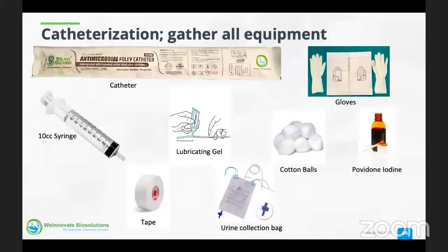Now catheterization is a very standard procedure, yet it is a very critical procedure which requires completely aseptic conditions and needs to be performed by a trained nursing staff or a doctor. So when we are talking about preparation of the catheterization, there are few things that you have to start with doing. So infection is a major risk in urinary catheterization. That is why you have to start preparing.